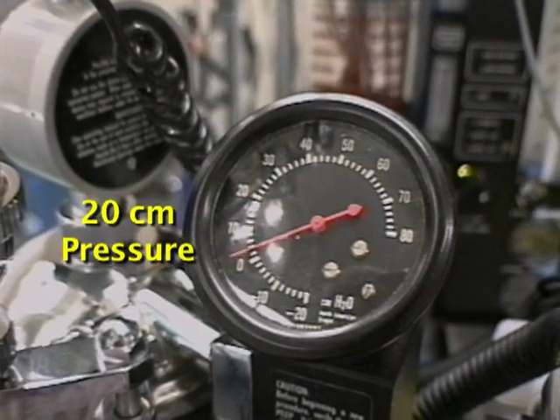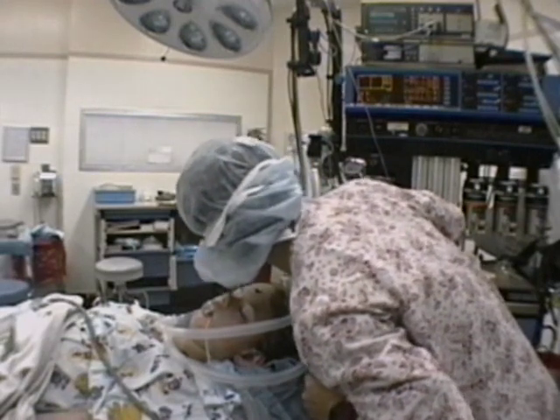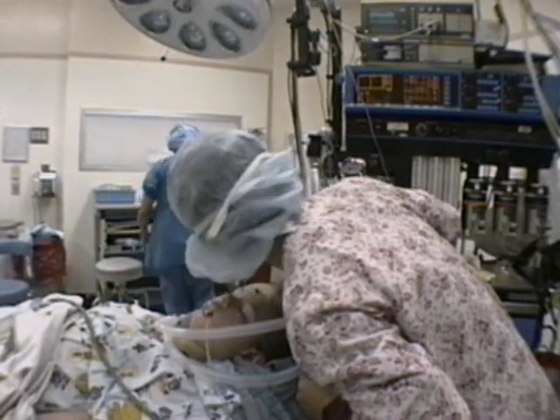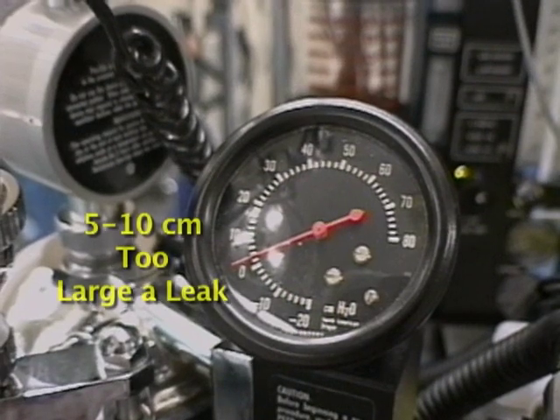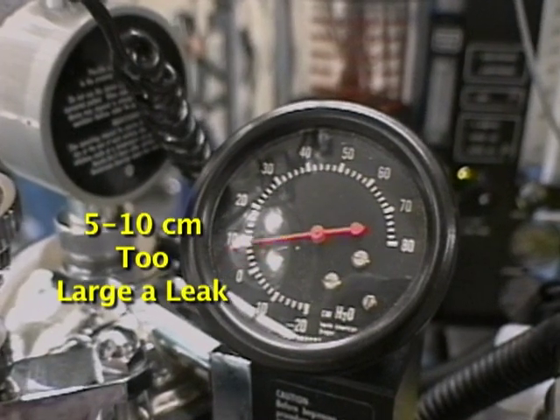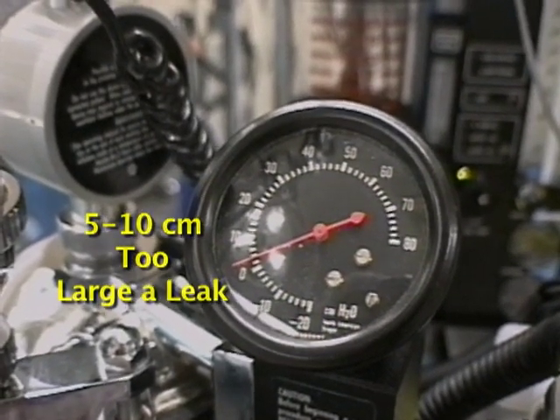The absence of a leak at 20 centimeters means that the tube is too large and pressing on the inside of the cricoid ring. Excessive pressure inside the cricoid can damage the mucosa and potentially injure the recurrent laryngeal nerves. A leak is too large if it prevents effective inflation of the lungs. Consider switching to a more appropriate tube size when the situation or the stability of the patient permits.